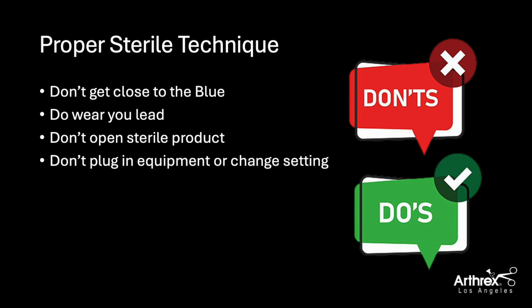With the safety aspect of that, I think also as we start to go through, anytime that we have disposables, we want to make sure that we are handing them to the OR circulator so they can open up, read off the expiration dates, indicated use or IFUs if they need to look towards those for any cleared indications. That way we can clearly support the case from 3 feet away, and also the fact that we keep a confidentiality of our support there, and we're not potentially de-sterilizing certain products.